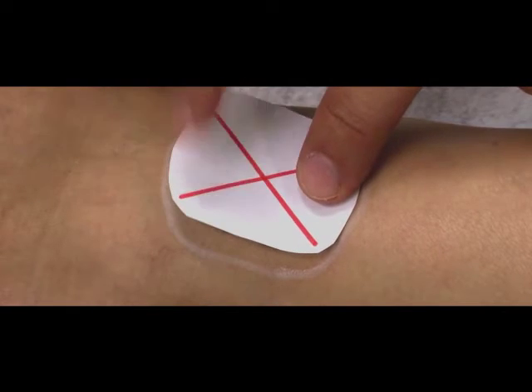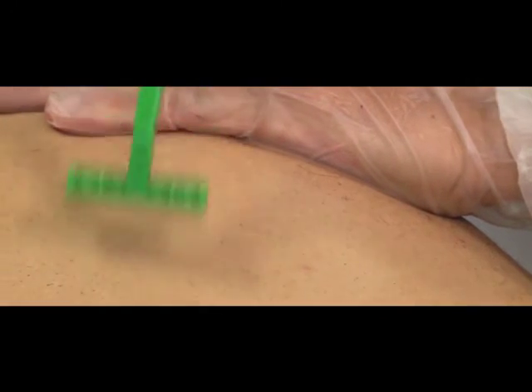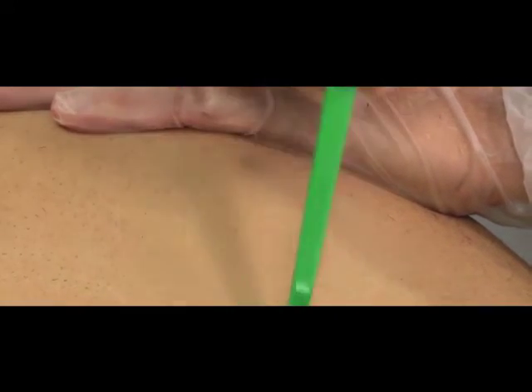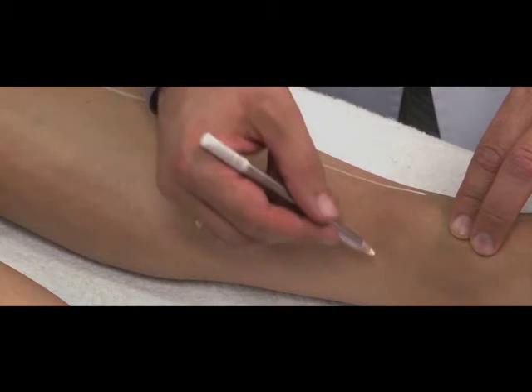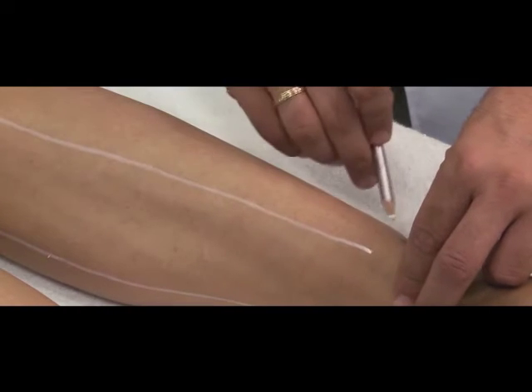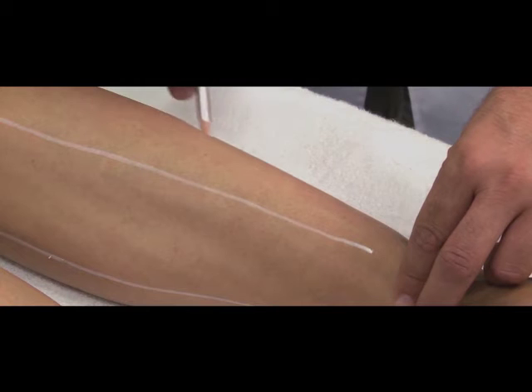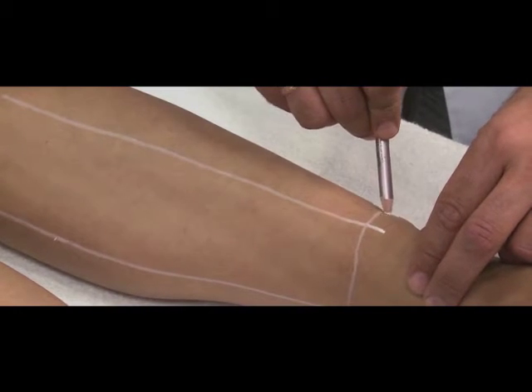Prior to beginning the sessions, you will want to know what the distribution and caliber of the hair is. Once this is determined, it is best to have the patient shave at home 24 to 48 hours prior to the session. There should be little or no hair on the surface of the skin. This is very important for 2 reasons. First, this will allow the skin to recover from the shaving and prevent folliculitis. Second, there will be enough hair growth to see where treatment is needed.